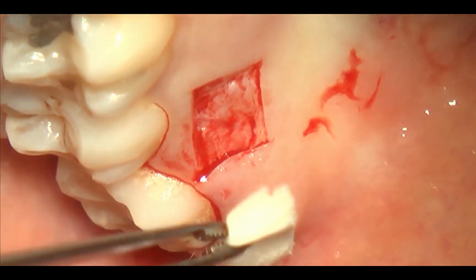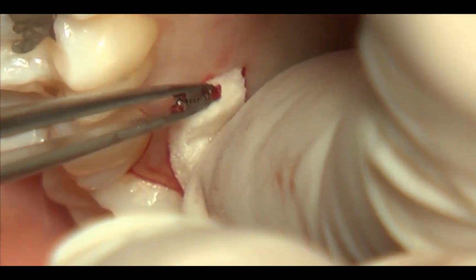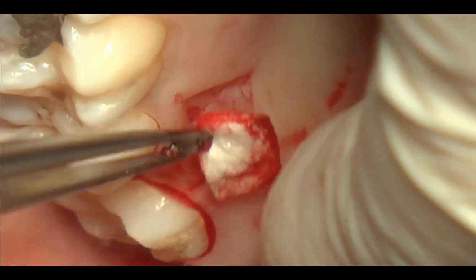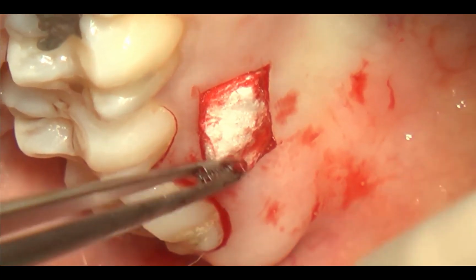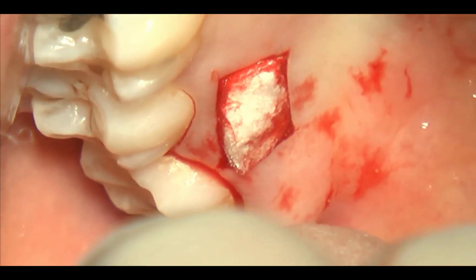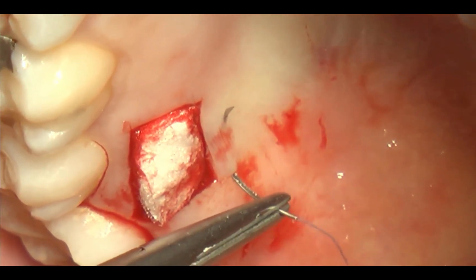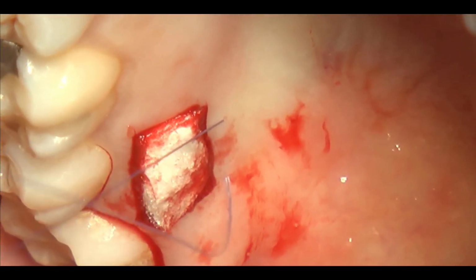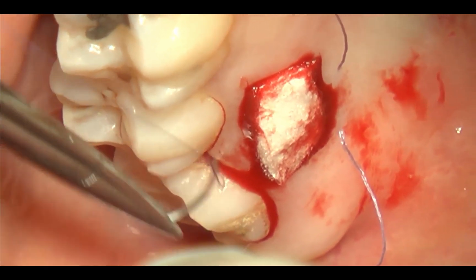That's it. You see that there is no need of nothing because it does not bleed at all, because it's very superficial, but just to show you the management of this material, we apply it on the wound area of the same size of the graft. We make a mattress suture starting from distal to mesial. We turn around the buccal aspect of the corresponding tooth because there is no surgery on this tooth.